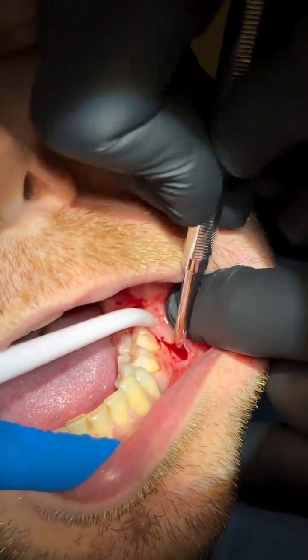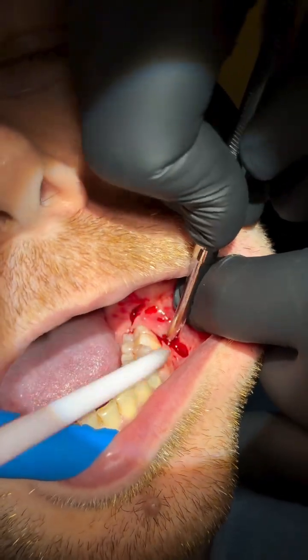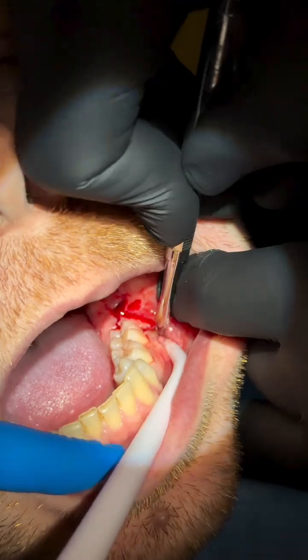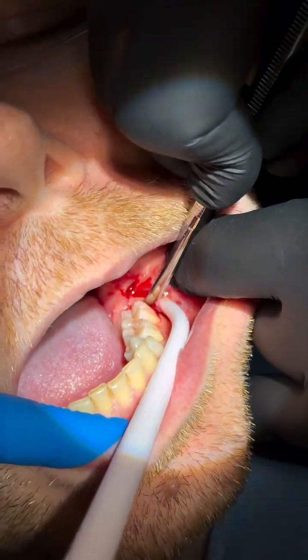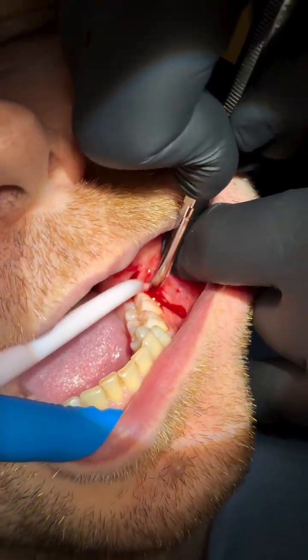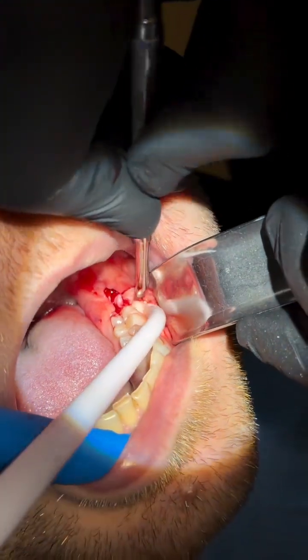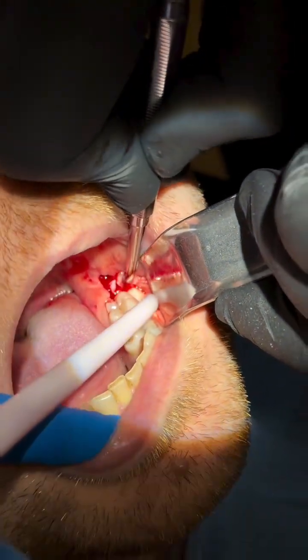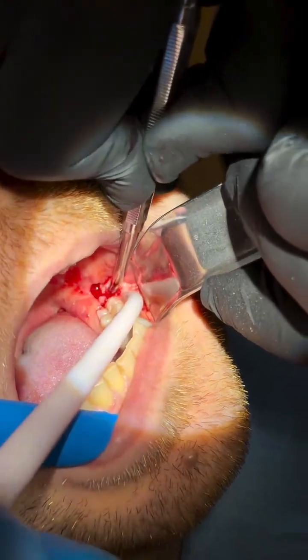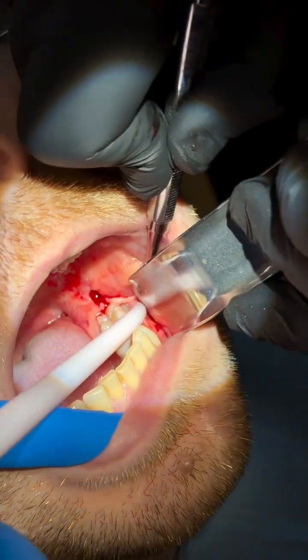I'm using the periosteal elevator to raise the flap. I always start from the relieving incision. I push back. You'll notice that there is lots of scarring, in this case from a previous operation. That's why raising the flap is a bit tricky. I'm using the Lax retractor or Minnesota retractor to protect the flap.